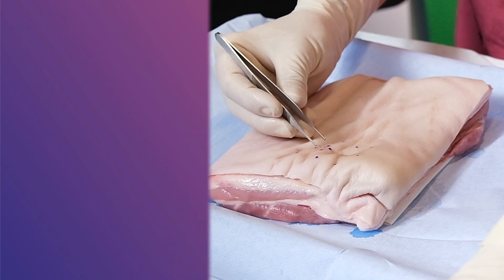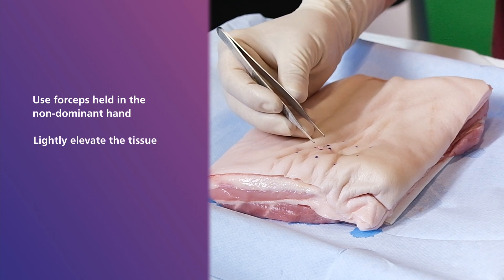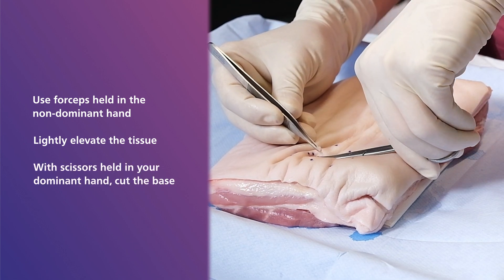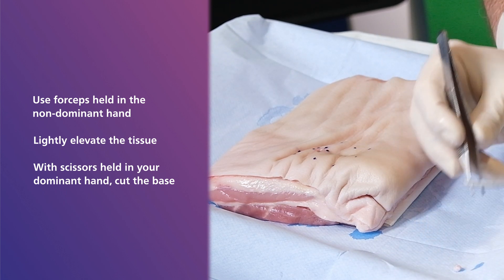Once you have successfully biopsied the specimen, the next stage is extremely important as the delivery requires careful handling to optimise its diagnostic yield and avoid a crush artefact. To do this, using forceps held in the non-dominant hand, lightly elevate the tissue. Then, with scissors held in your dominant hand, cut the base. Note that gripping the specimen with excessive force is discouraged.